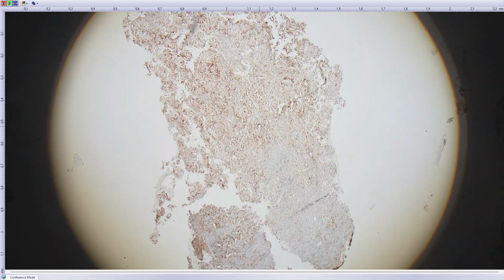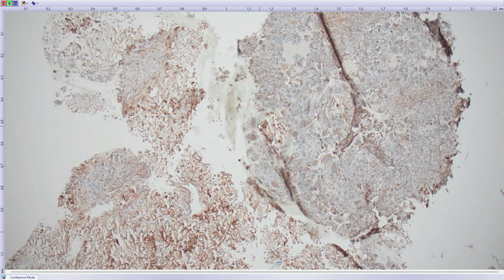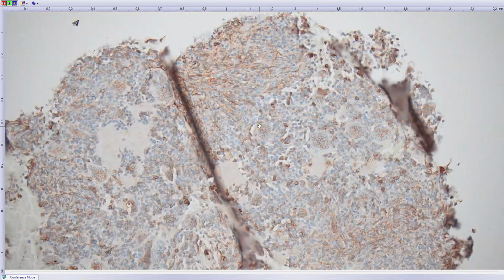I'm looking for some area without the calcifications. So the cells are, again, unquestionably positive. Phosphaturic mesenchymal tumors typically present with phosphaturia, osteomalacia, but there are some 10% of cases which don't have that, or maybe don't have that yet. This patient didn't have any abnormalities like that.